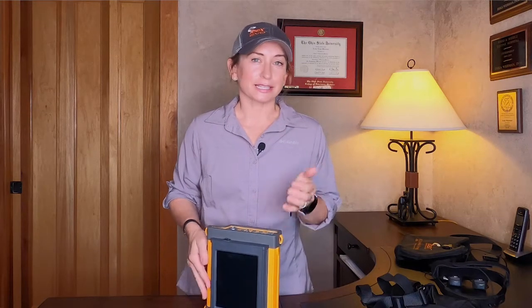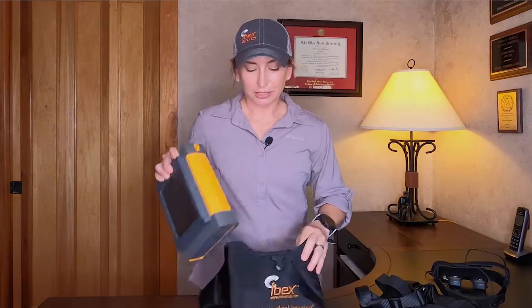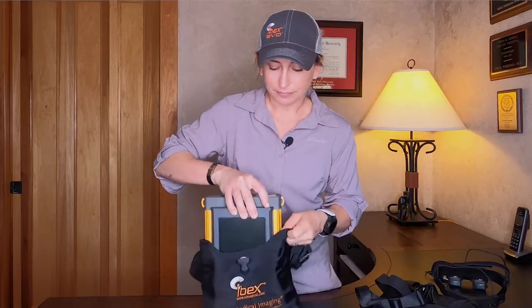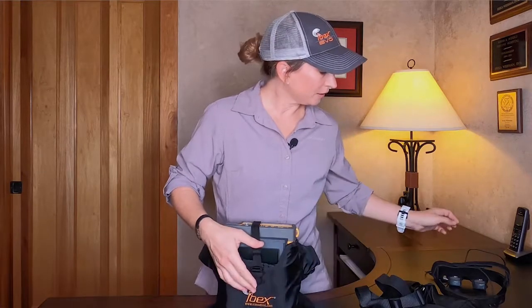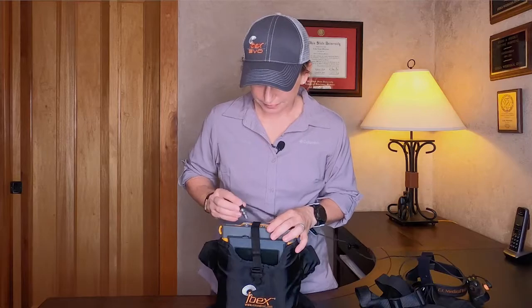The first way you can wear it is just within the ibex light waist pouch. It just slides right in, strap shut, and plug in your goggles and you're ready to go with a waist mounted system.